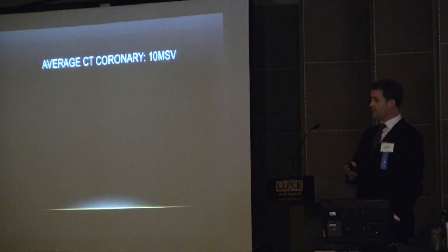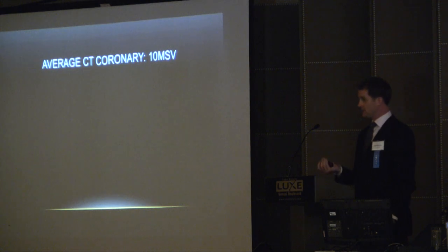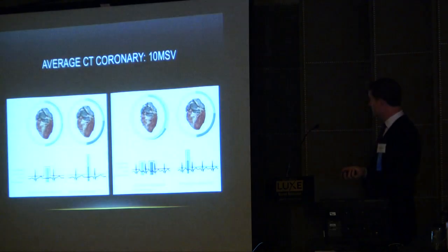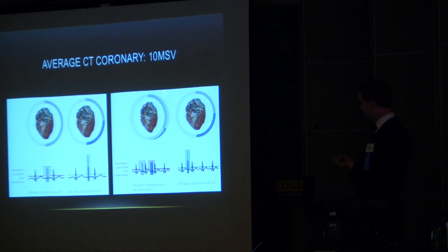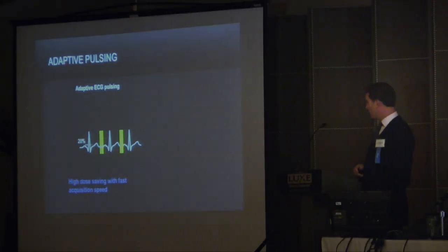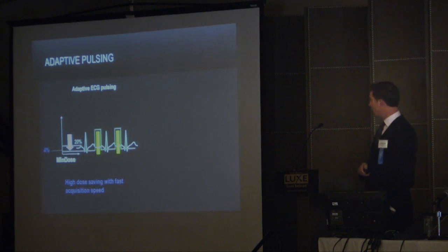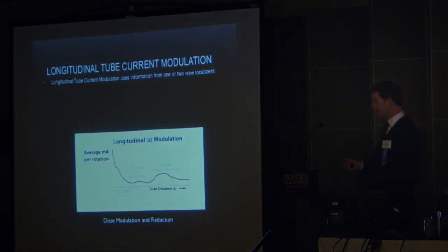As regards mammography, a mammogram would be about 0.4. So it's a big jump for you to think about doing a CT coronary. But for a nuke med study, for a cardiac MPI, it's about 20 millisieverts. So it's all relative, but it is important. But I'll tell you that with newer technologies, with faster scanning, with what's called tube modulation, where we drop the radiation dose for everything except for the exact point that we want to look at in the cardiac cycle, where we can do things like ramping it up very quickly with high-end scanners, and then where we're able to modulate the amount of radiation that goes through dangerous areas like female breast tissue.